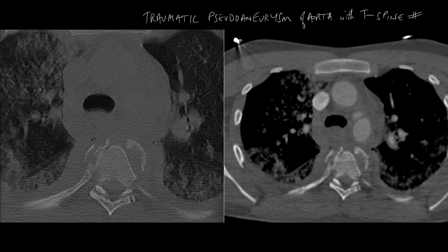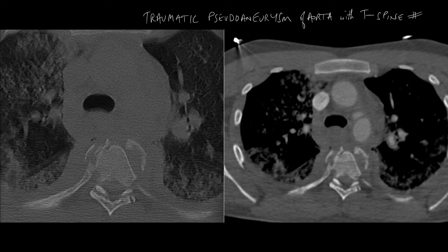This patient was a victim of a road traffic accident and you can see clearly that there is a pseudoaneurysm arising from the undersurface of the aortic arch. Note also the severe mediastinal hematoma and the associated thoracic spine fracture. There's no doubt in this case that this is a pseudoaneurysm.